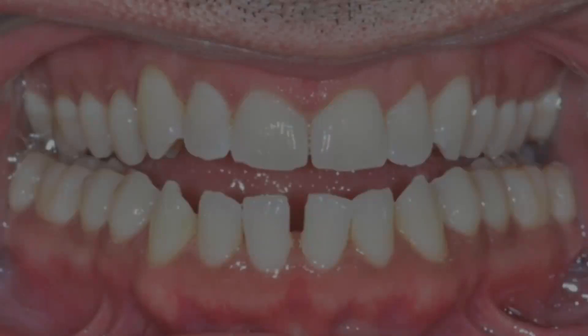Here we have James's initial bite, and a couple of things stand out. Normally, the top back teeth should be wider than the lower back teeth, but in James's bite the lower back teeth are quite a bit wider than the upper back teeth. Also, looking at the front teeth, the top front teeth normally should vertically overlap with the lower front teeth by about 20% to 30% of the length of the lower front teeth.